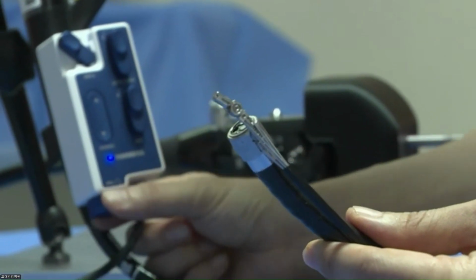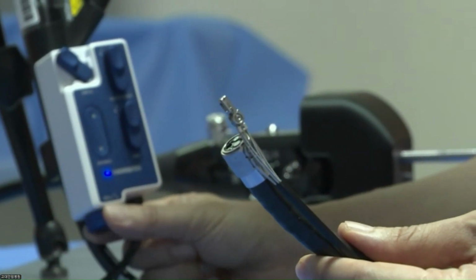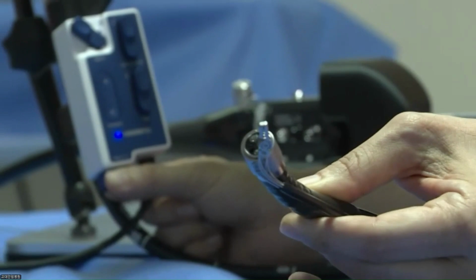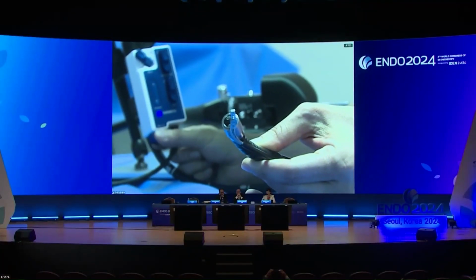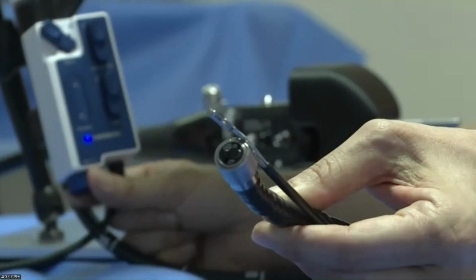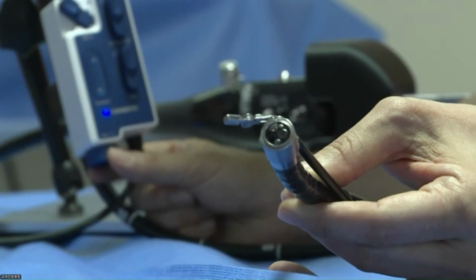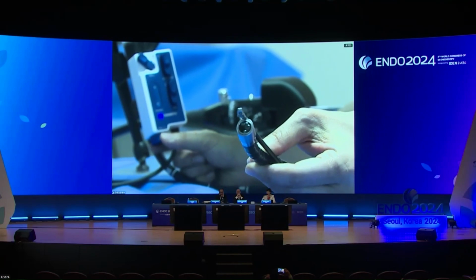And lastly, the roll motion. The other side rolls to 90 degrees, and the upper side has a 90 degree roll motion. Can you see that? Yes, very well.